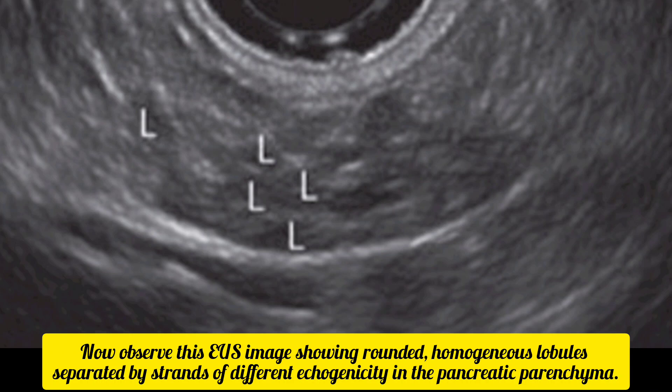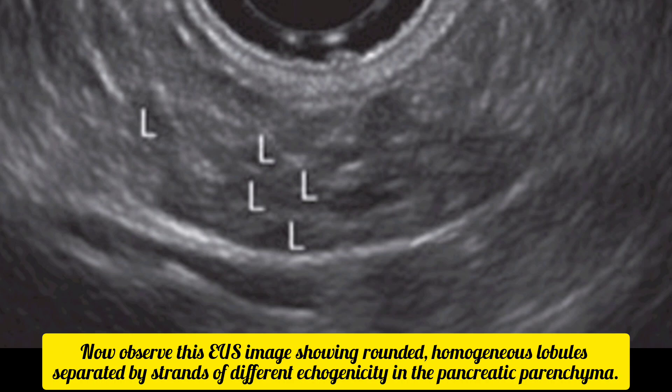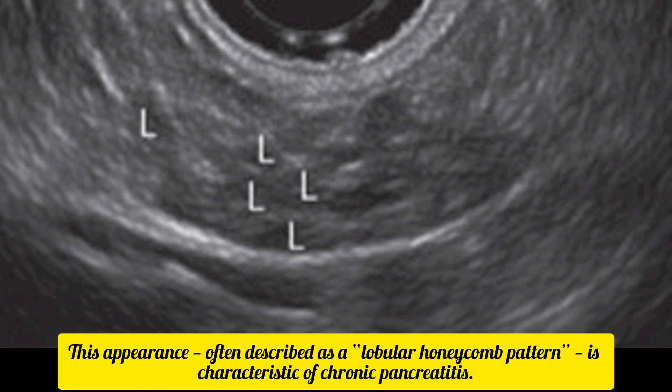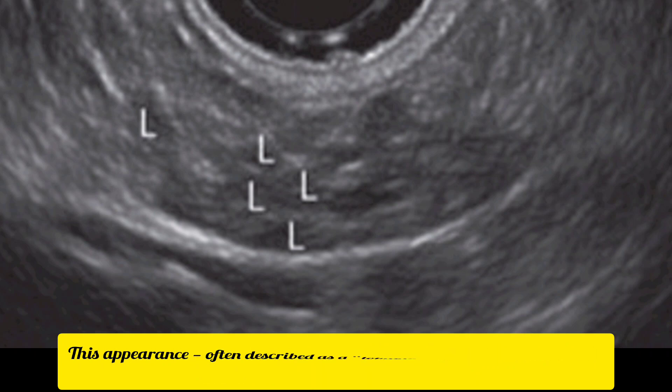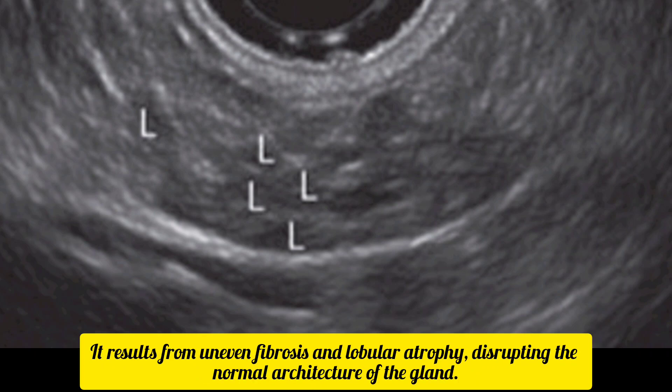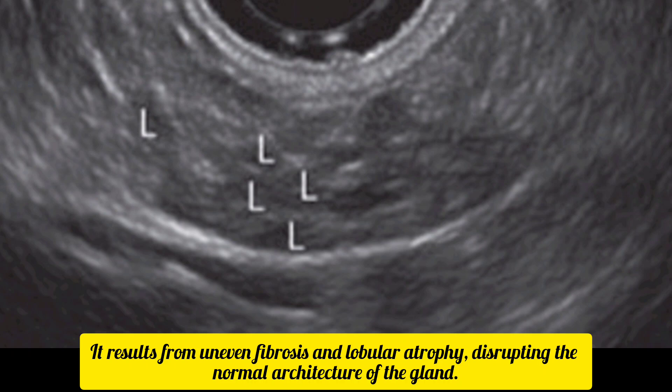Now observe this EUS image showing rounded, homogeneous lobules separated by strands of different echogenicity in the pancreatic parenchyma. This appearance, often described as a lobular honeycomb pattern, is characteristic of chronic pancreatitis. It results from uneven fibrosis and lobular atrophy, disrupting the normal architecture of the gland.